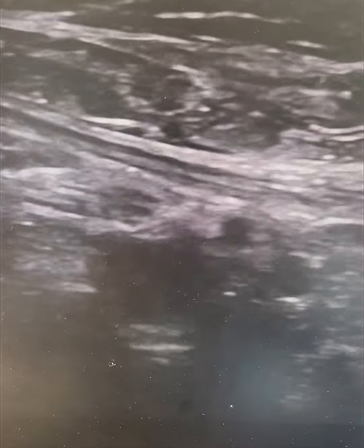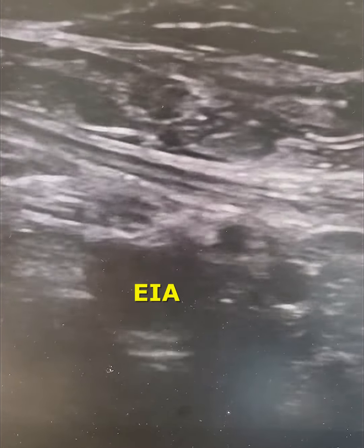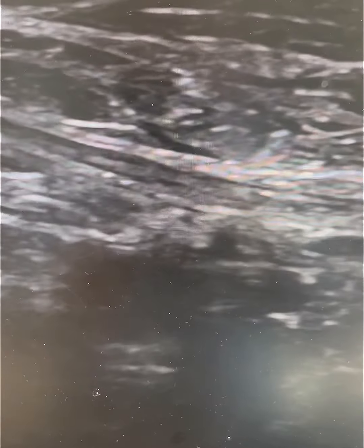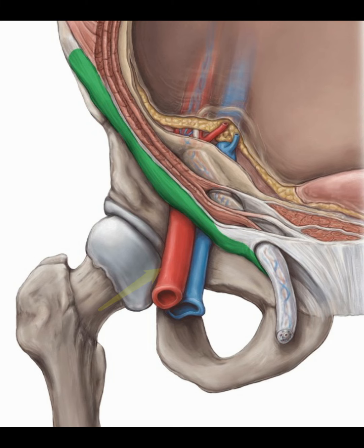Ultrasound is excellent at identification of the common femoral artery bifurcation and how to avoid low sticks. However, best access practices usually incorporate fluoroscopy with ultrasound in order to avoid high sticks. And this is sometimes not possible with ECMO cannulation in a sick patient at the bedside or arterial line placement in the ICU. As you see here, just plain ultrasound guidance sometimes can lead to high sticks, which takes us back to basic anatomy.